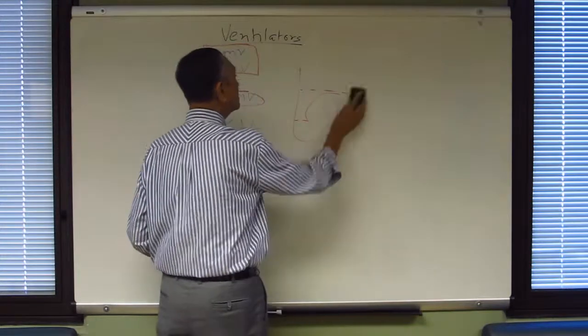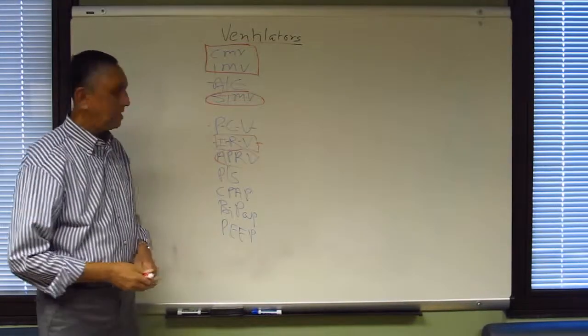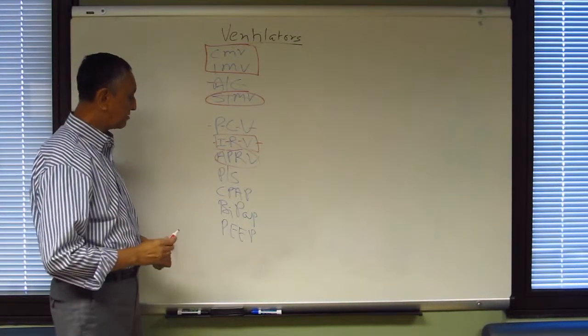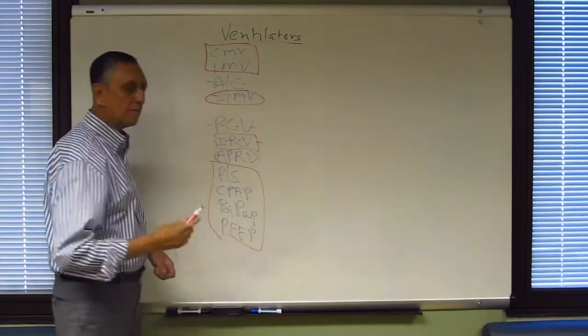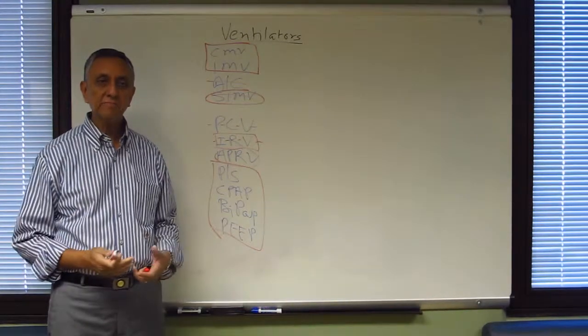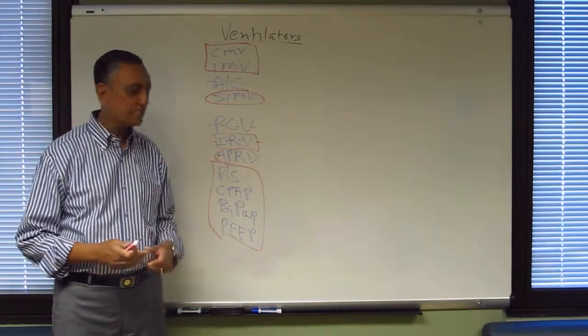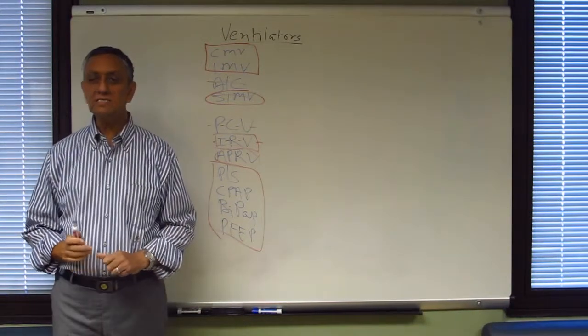Okay, so these are the most commonly used modes. Now we have these 4 things that we want to talk about, which are not primary ventilatory modes. They are adjectives or adjunct modes. And one of them is a misnomer.